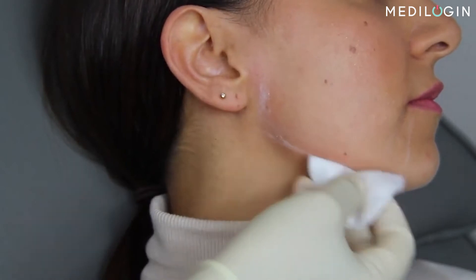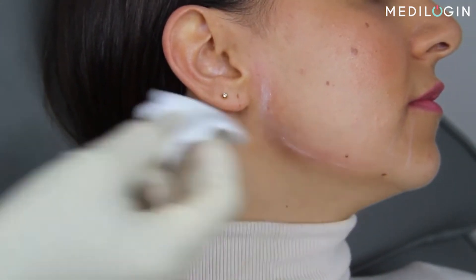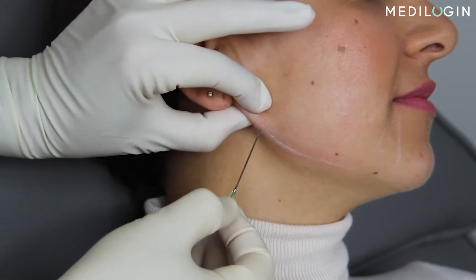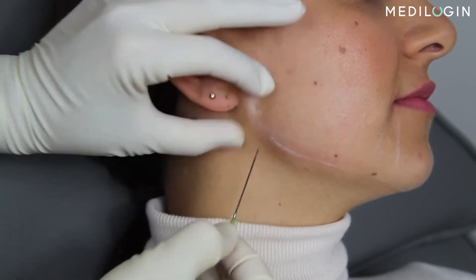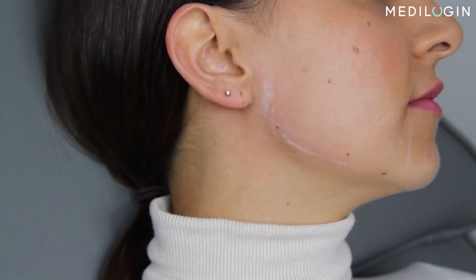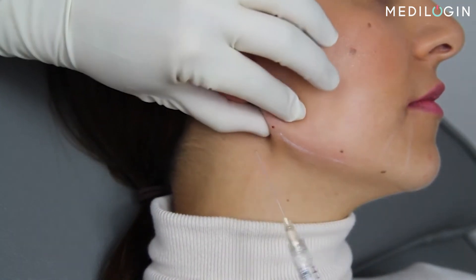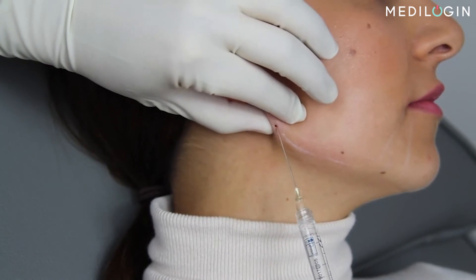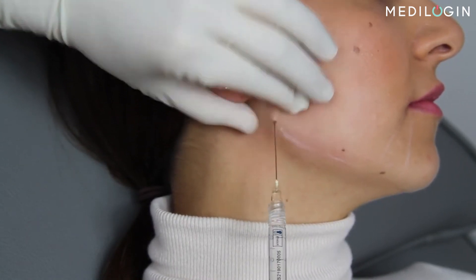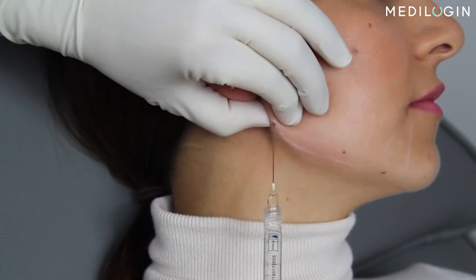Thoroughly disinfect the area to be treated. Next, use a sharp needle to penetrate the skin, and replace it with a blunt needle. Carefully insert the blunt needle along the previously marked line, and use gentle pressure, keeping in mind that a little bit of resistance is normal.